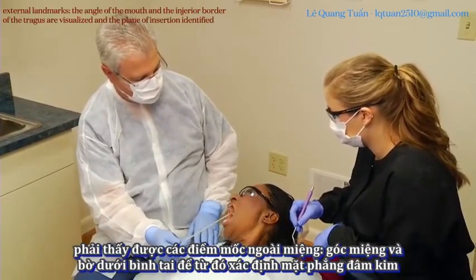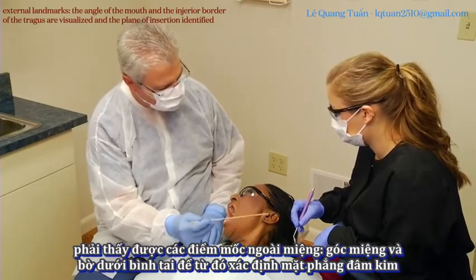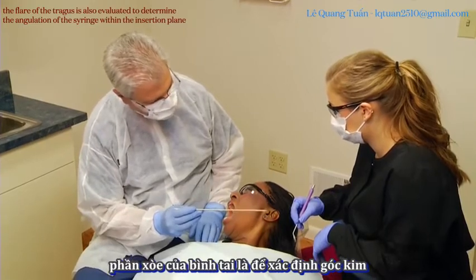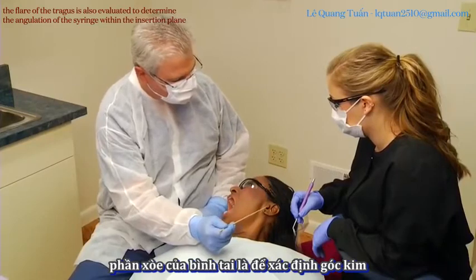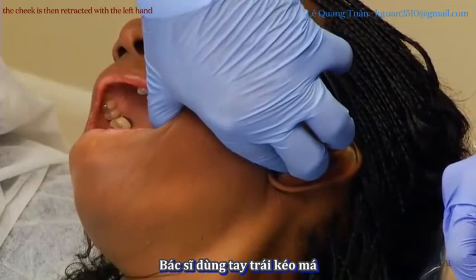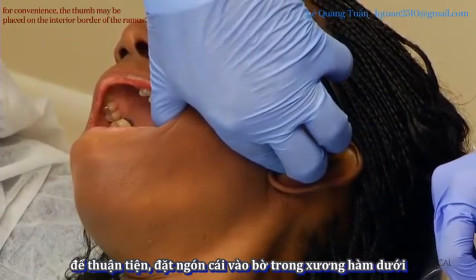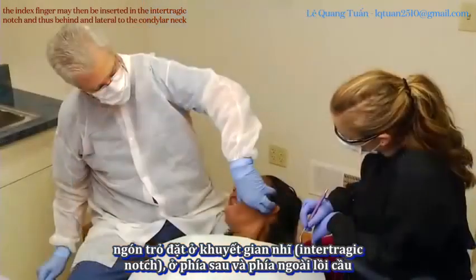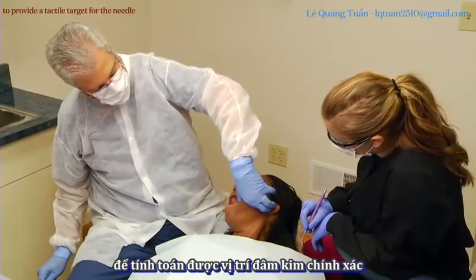External landmarks, the angles of the mouth, and the inferior border of the tragus are visualized and the plane of insertion identified. The flare of the tragus is also evaluated to determine the angulation of the syringe within the insertion plane. The cheek is then retracted with the left hand. For convenience, the thumb may be placed on the anterior border of the ramus. The index finger may then be inserted in the intertragic notch and thus behind and lateral to the condylar neck to provide a tactile target for the needle.